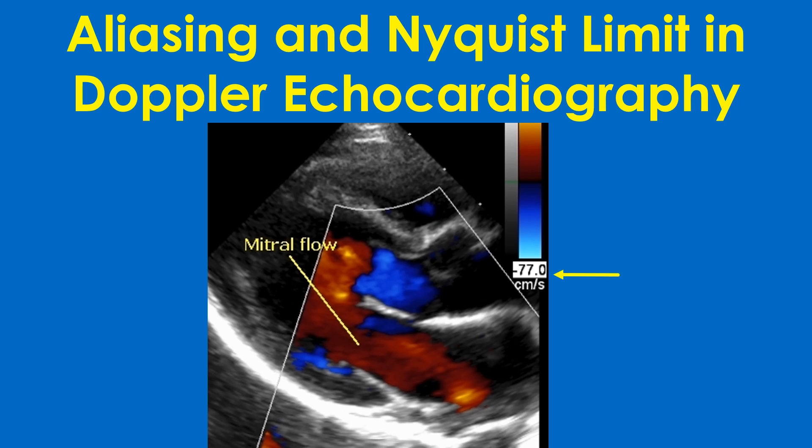Here the flow away from the transducer in blue color has a Nyquist limit of –77 cm per second. The Nyquist limit for flow towards the transducer is not seen in this image as it has been cropped. When the Nyquist limit is exceeded twice, the color shifts back to the original color — this is known as the second wraparound.